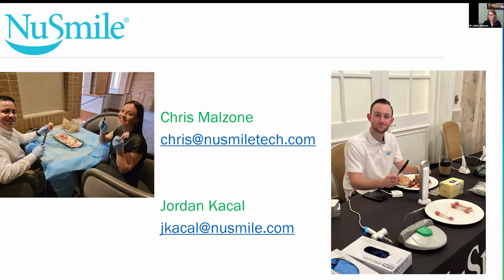Very important. And some people really love it. We have one doctor in our office, Clark made the decision. He's like, okay, everybody, quit putting it in cruise control because we're all expecting it to be in drive. We're just going to all do the same thing because it gets kind of frustrating. And one of the docs was like, oh man, I like that because I like to kick back, cross my legs, put my hands up for a while, stretch it out, and not have to be very focused on it. So it's all personal preference.